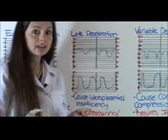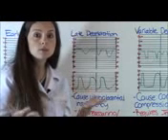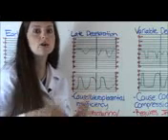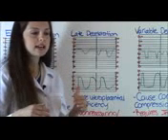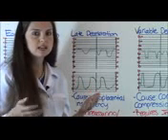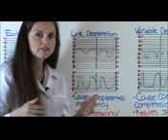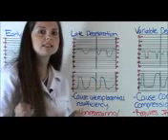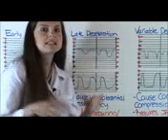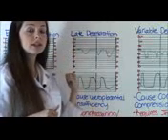So remember, the key with this, mom would have a contraction, nothing would happen to baby's heart rate until after the contraction was over. Think of this like a delay. The placenta and the uterus, it's insufficient. It's not doing its job. And so everything's slower. Whenever the mom's having a contraction, it's not really affecting the baby's heart rate until afterwards because it's insufficient.